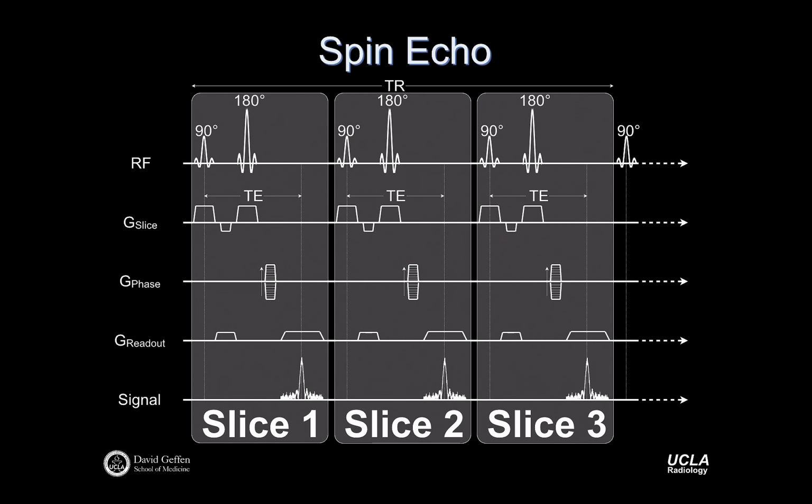So this is pretty clever. And so this principle of slice interleaving looks as follows. We basically excite, refocus, and read out for slice 1. Excite, refocus, read out. You have your data. So let that slice recover, let the transverse magnetization decay, let the longitudinal magnetization regrow, and just go visit another slice.